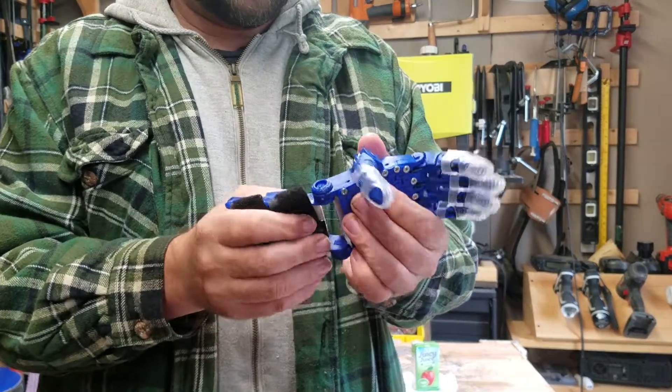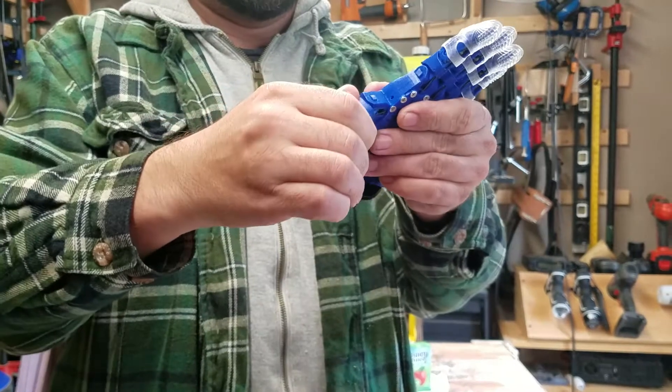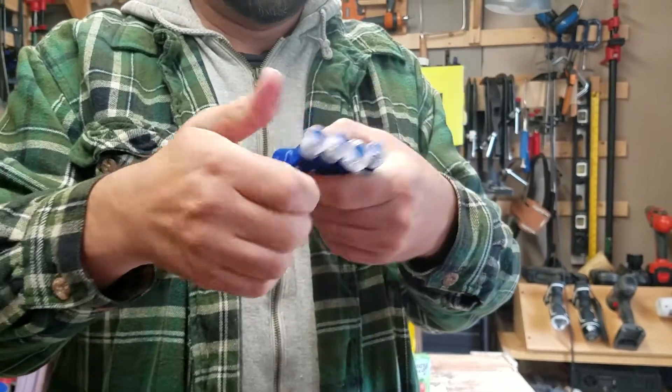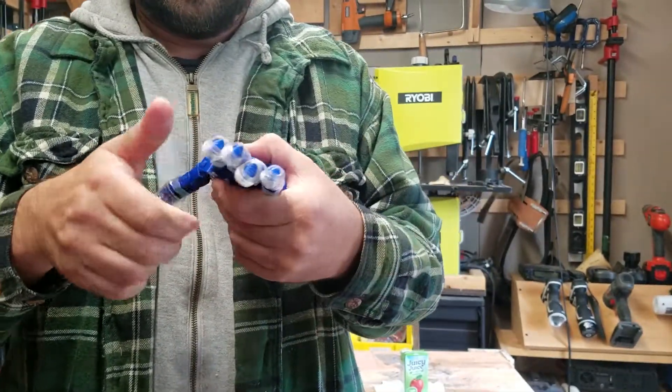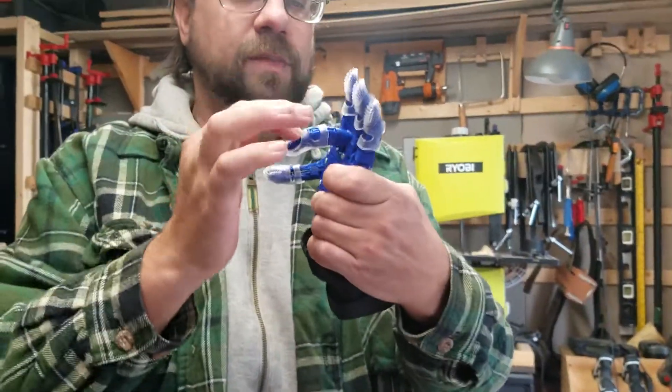Now we'll stress test: beginning by bending the fingers and thumb backwards, and showing independent movement of each finger.